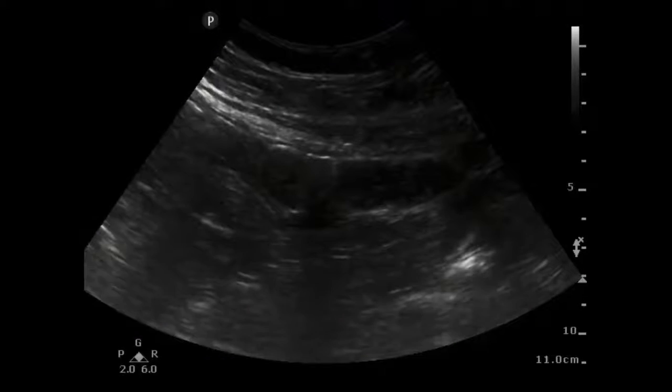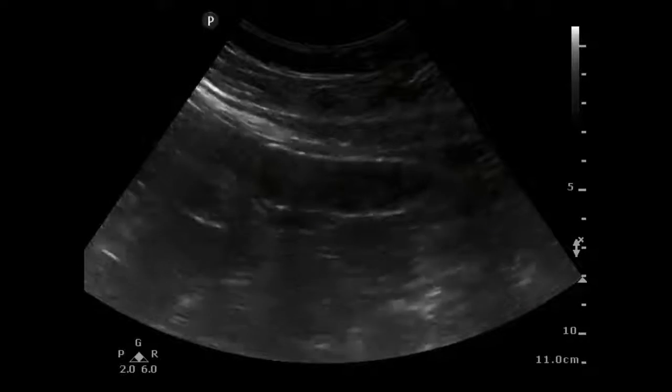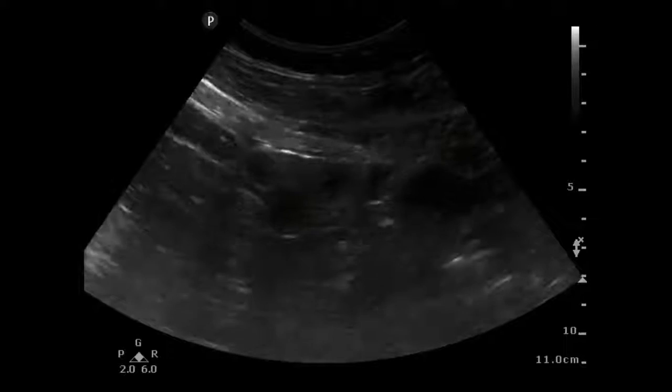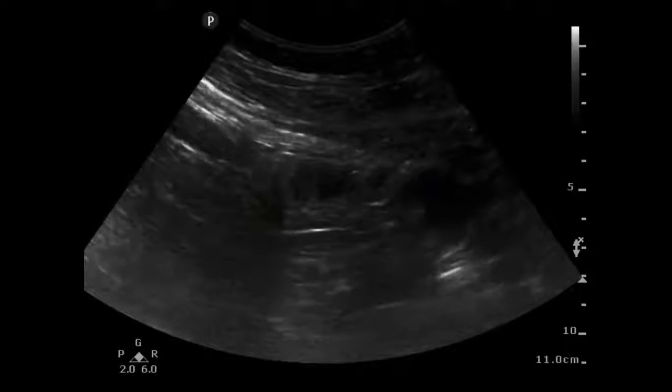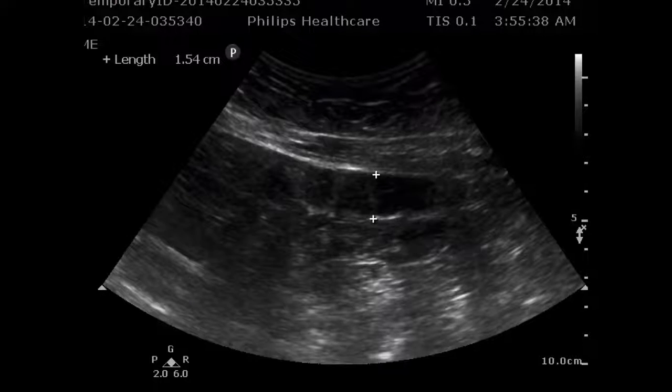When evaluating a patient for small bowel obstruction, if they don't have a small bowel obstruction, often you won't see any bowel at all — you'll just be seeing the air represented by A-lines. Occasionally, however, you will be able to see normal bowel in a patient without a small bowel obstruction. This is what normal small bowel looks like. You can see the feculent material inside of it really only moving in one direction. And if we actually measure it, we can see that it is below our threshold of 2.5 centimeters.